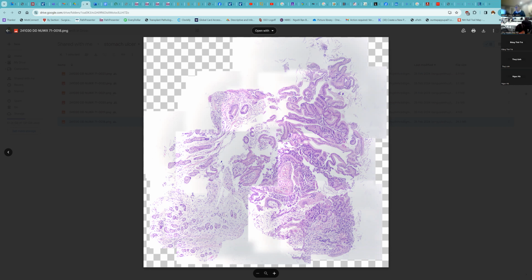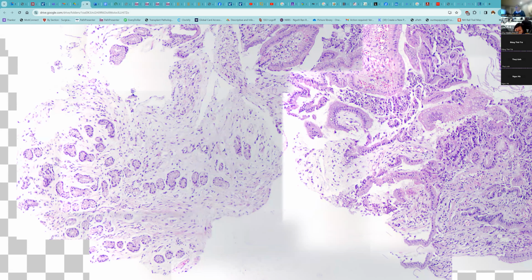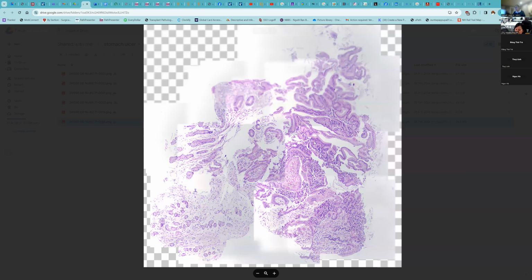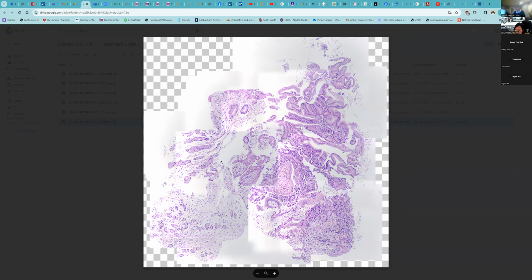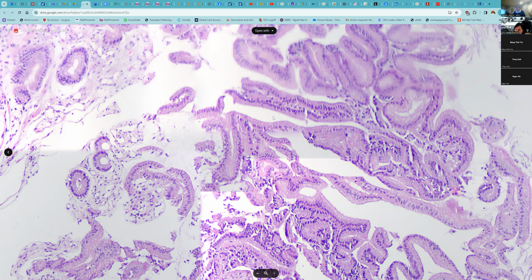So we look at these fragments of tissue. Obviously it doesn't have any oxyntic mucosa. It has antral type glands. And we can see there's a lot of loose stroma with some benign serous glands here. And then we have this superficial tissue that shows more of the epithelium is more foveolar or gastric lining type of surface epithelium.